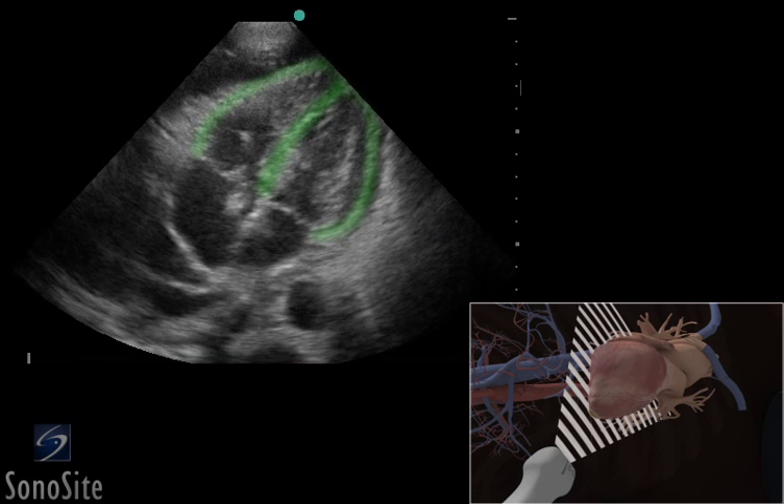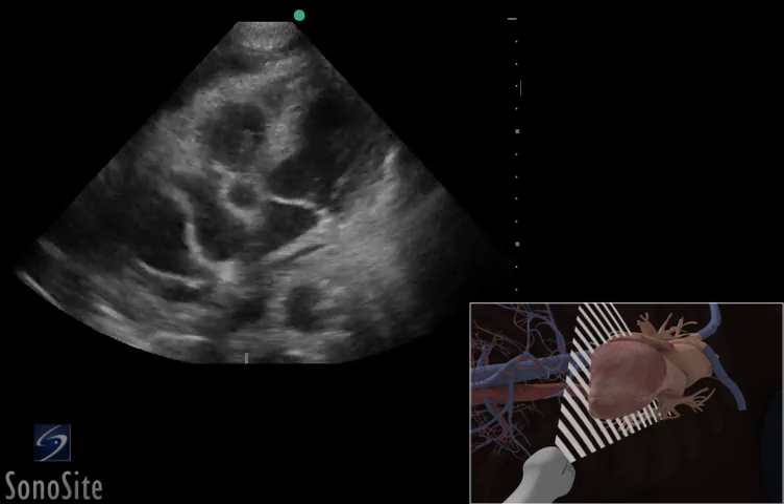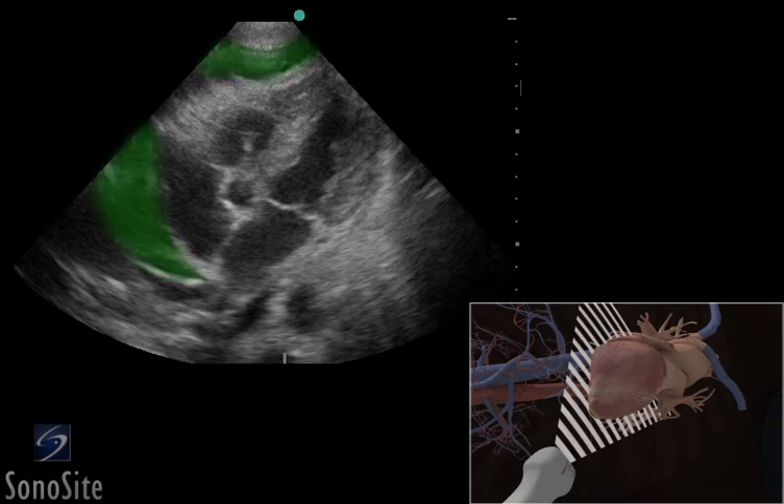The myocardium will appear gray and the blood-filled chambers will appear hypoechoic. The ventricles are in the near field and the atria are in the far field of the image. A pericardial effusion will appear as a dark anechoic fluid collection surrounding the heart.